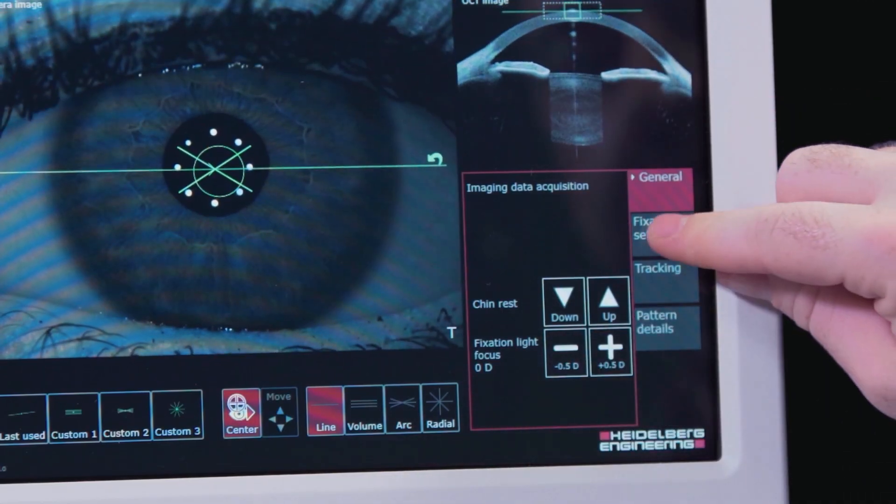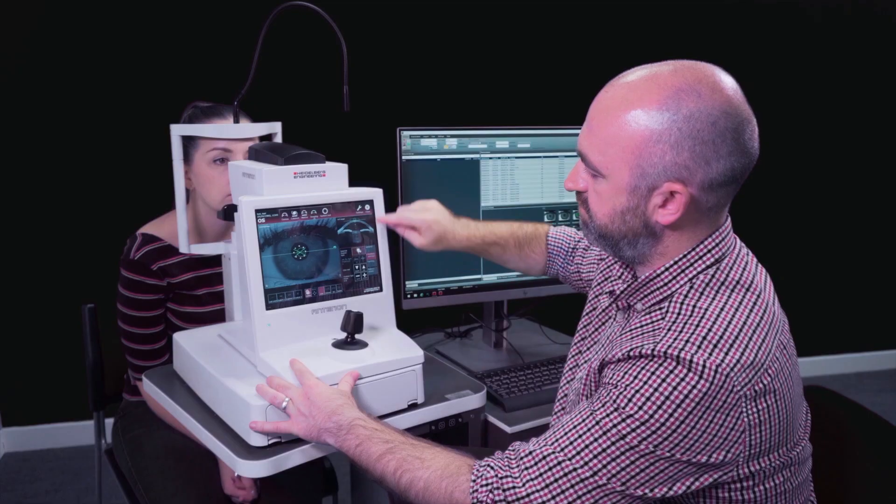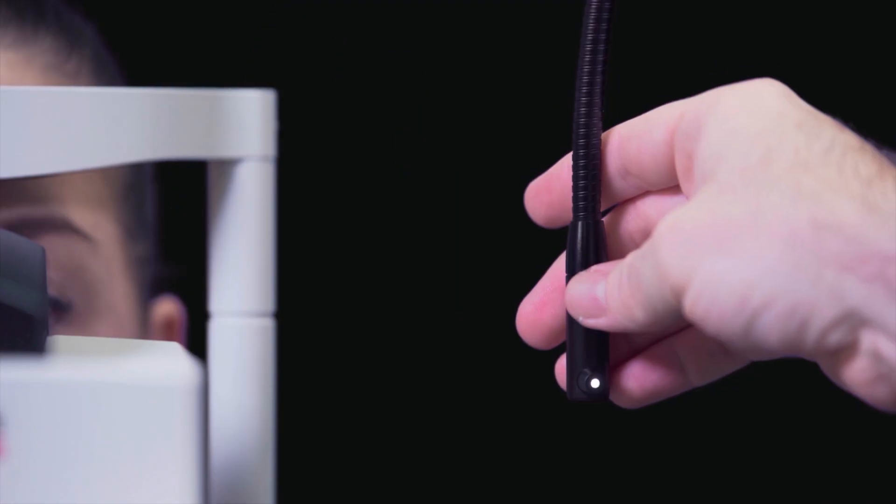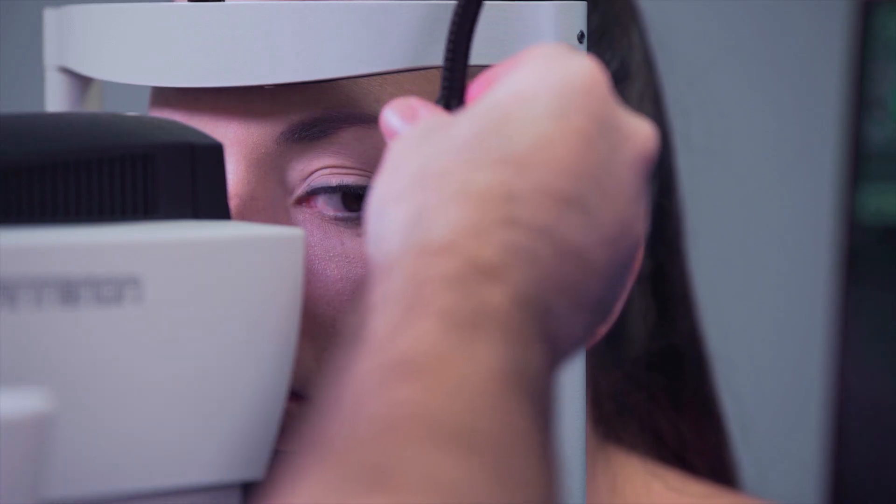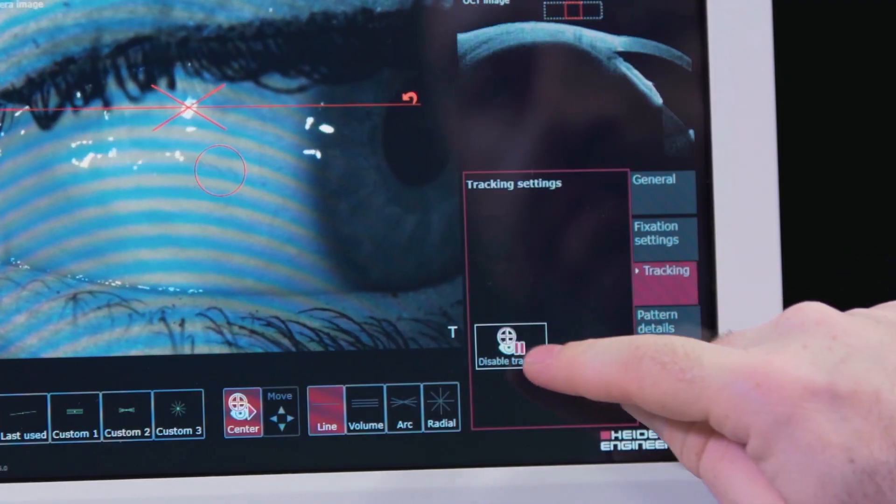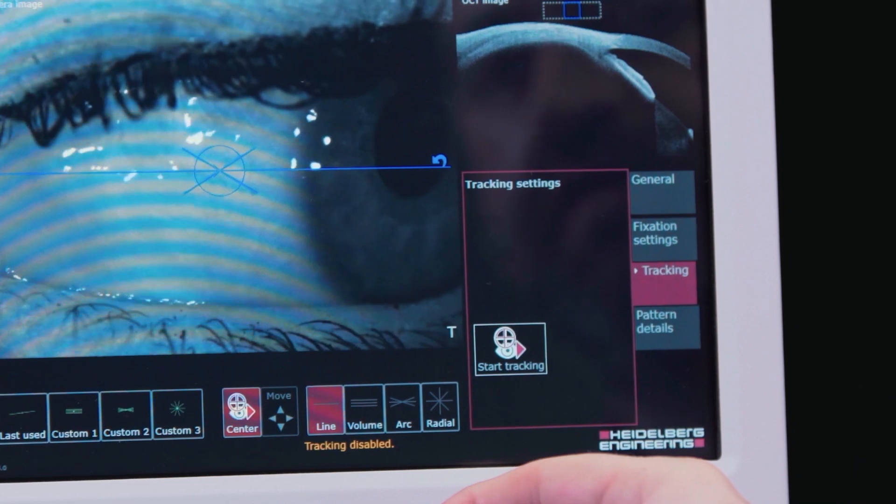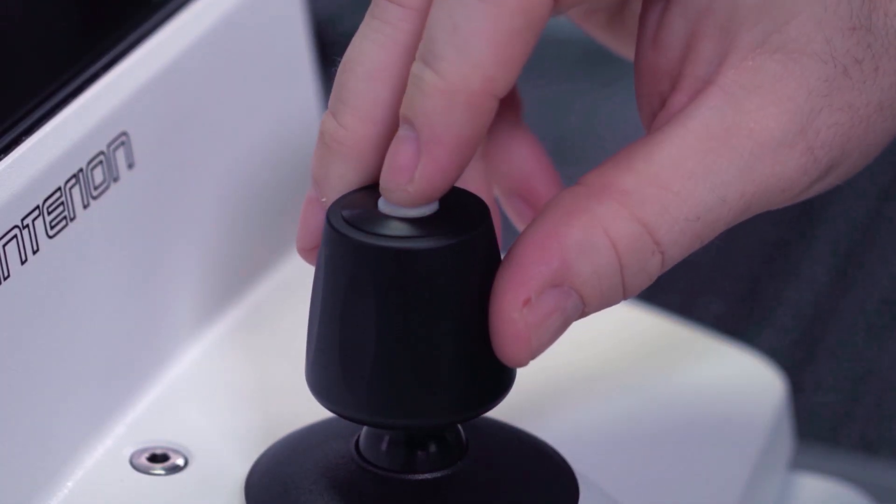To acquire images of paracentral structures, the external fixation must be used. Position the external fixator until the structure you wish to image is correctly displayed. With tracking disabled, you will notice the scan line is blue. Acquire the image by pressing the joystick button.